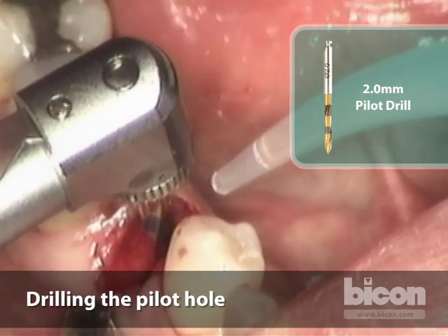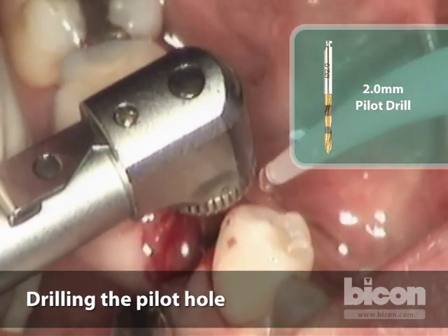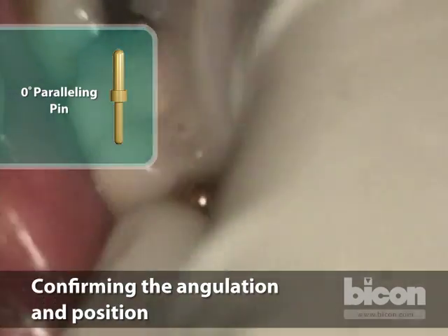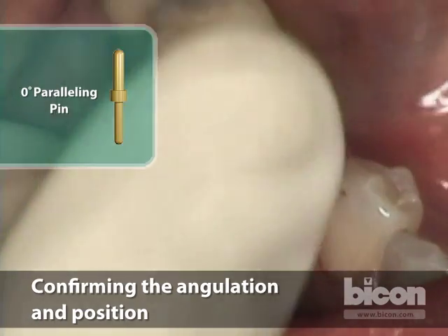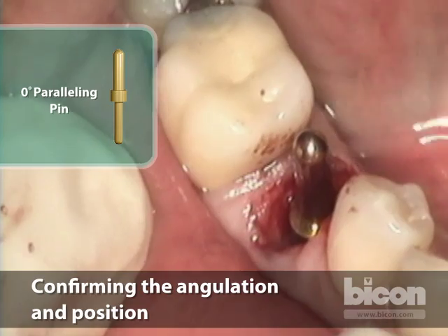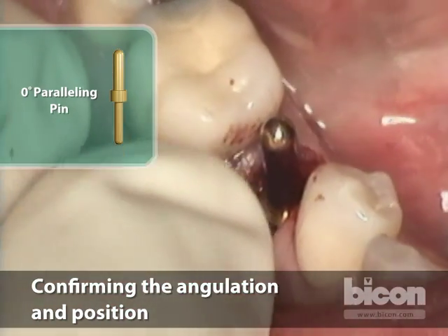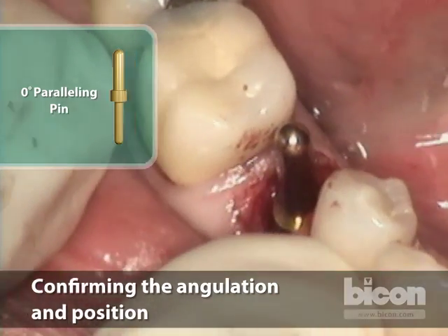Notice the two-handed technique for stability. We will place the implant in about another millimeter or so, then take a paralleling pin to check our positioning. The paralleling pin is angled to mimic the root of the bicuspid. Because of a slight dilaceration of the first bicuspid's root, we aim slightly distal — but this is immaterial as long as our emergence is strictly in the middle of that imaginary line joining the two contact points.